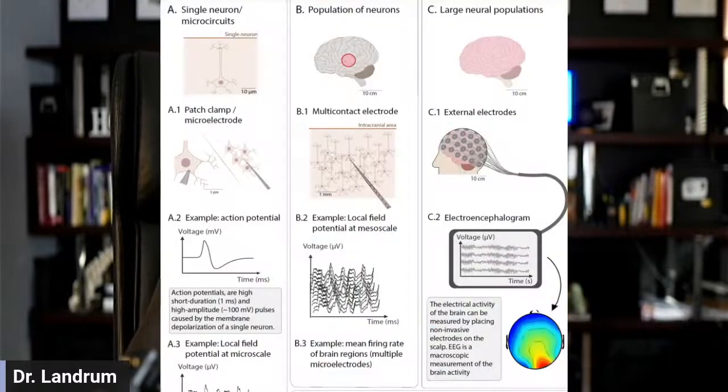We're taking that subtle electrical energy, and we're using a device to determine what that electrical energy looks like. If we were to give another kind of cartoon representation of that, it looks like the following. You have these neurons that have circuits. They traditionally will have an electrical energy that you can see on the left-hand side. Then you have these groupings of neurons that end up producing a much larger signal. And bigger than that, you have the whole brain that we can look at using electrodes, something called an electroencephalogram. And that's that EEG that we referenced before.